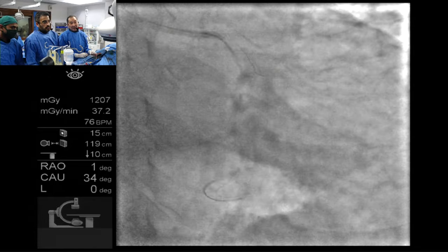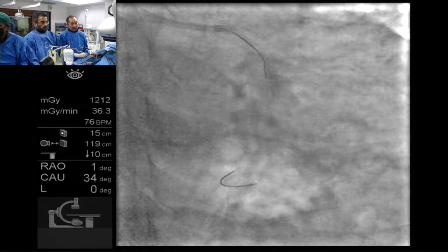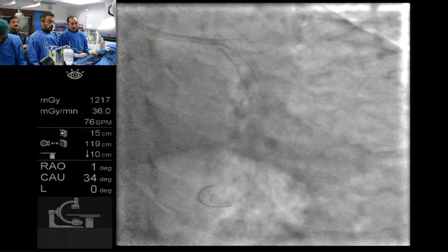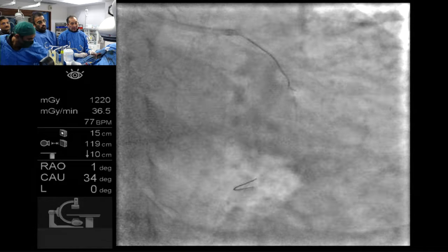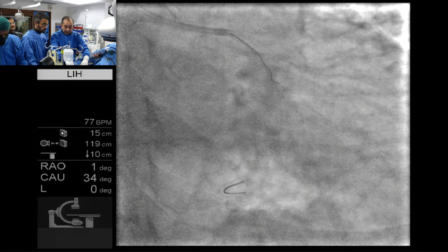You don't have Supercross? Okay, so open the Pilot 50 for me, please. I think you're under the strut there. It's kind of curling up on you. Huh? Yeah. Let me see how the wire behaves. Yep, doesn't look good, the wire. Okay. This is a Pilot 50. All right.